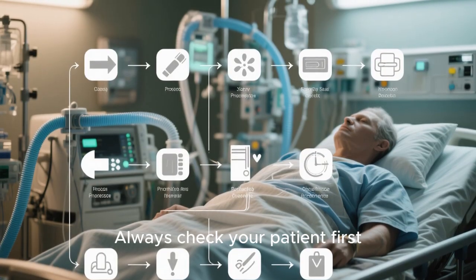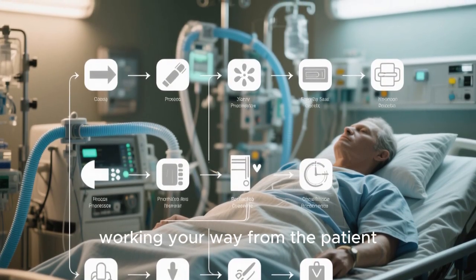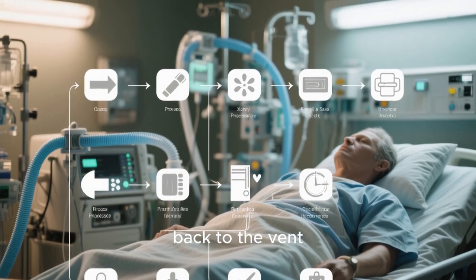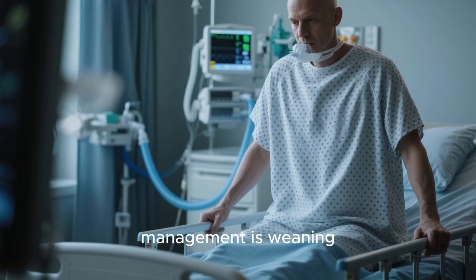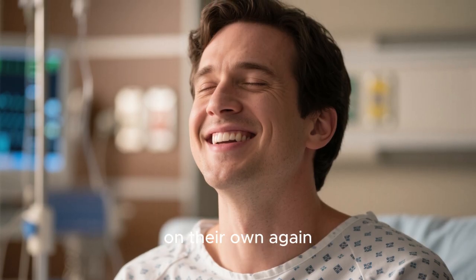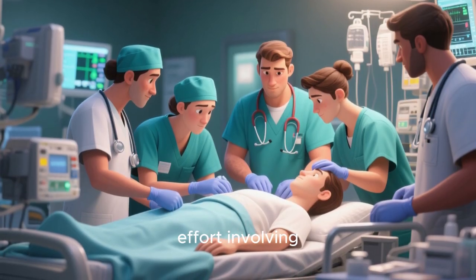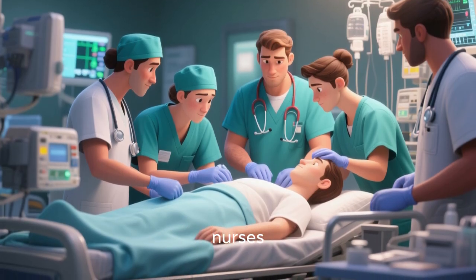Always check your patient first, then the machine and the tubing, working your way from the patient back to the vent. Finally, a huge part of ventilator management is weaning. The ultimate goal is to get the patient breathing on their own again. This is a collaborative effort involving doctors, respiratory therapists, and nurses.